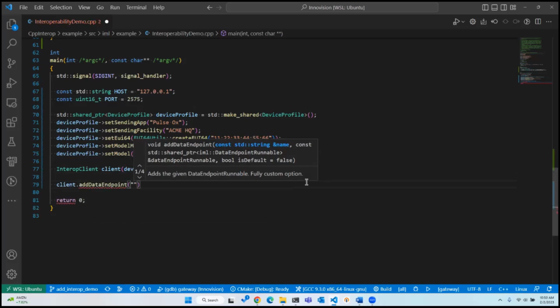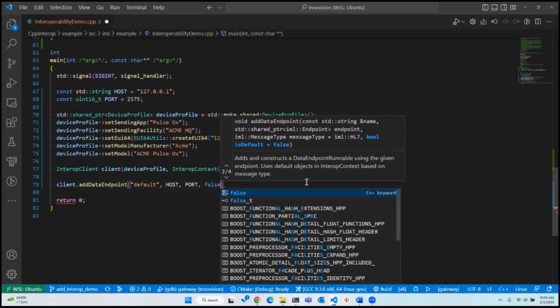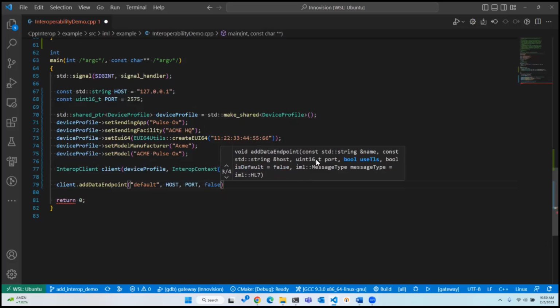So I'm going to add a data endpoint. And I'm going to name this the default one because I know in this case I'm going to have no other data endpoints, but you could have more than one. I'm going to set my host and port. And then I'm going to set use TLS to false. So here I've got my name, I've got the host and the port. Use TLS, I'm going to set to false. We're not going to use that for this demo.